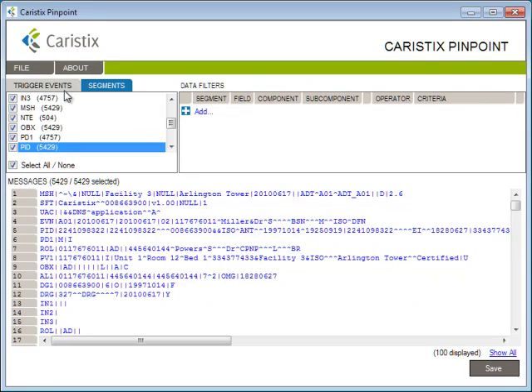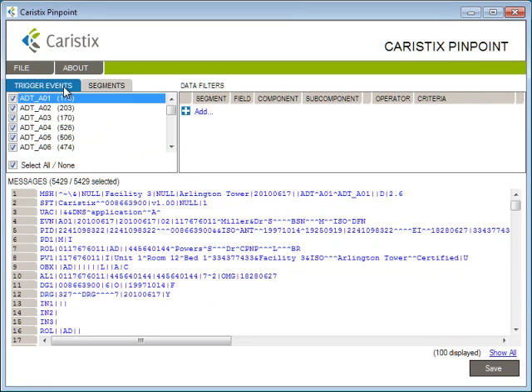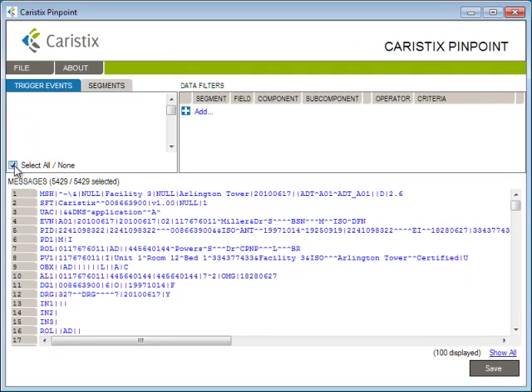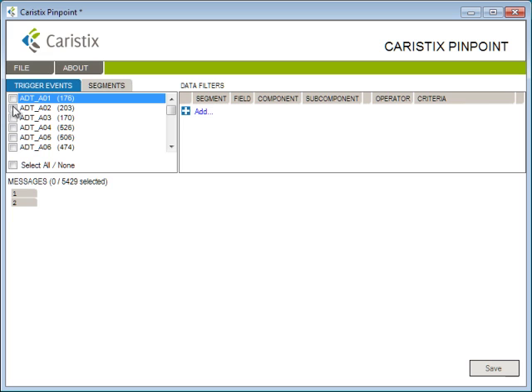It's the same basic procedure if you're looking for a set of trigger events. Click on the trigger events tab. And let's say you're looking for patient admissions. So you clear your checkboxes and you select the ADT-A01s.